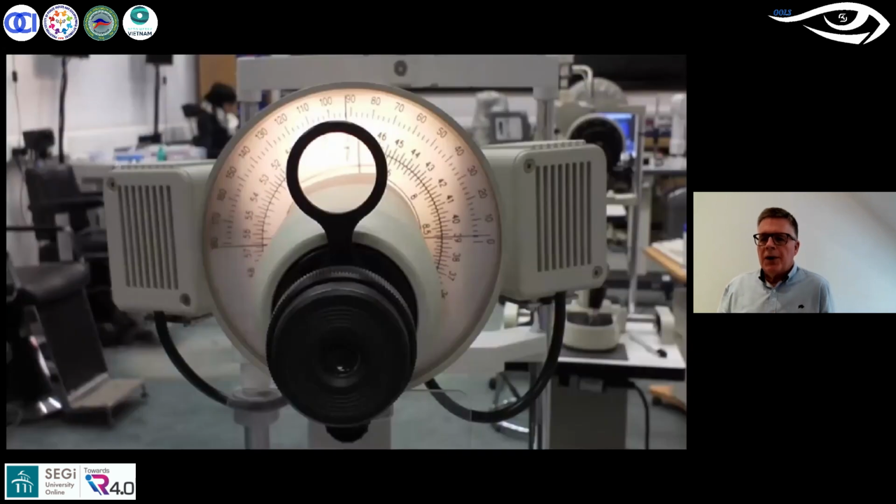So we spin forward now to a modern keratometer, and we ask, have we shed any light on the benefits of keratometry? This is a keratometer in one of the UK university teaching rooms. Has it changed that much? And the answer is no, not really. The theory and the practicality of keratometry has not really changed that much in over 100 years.